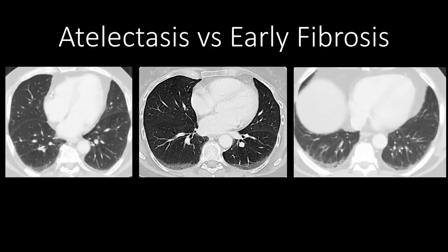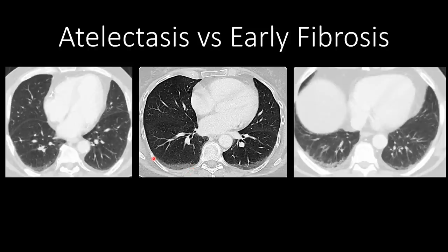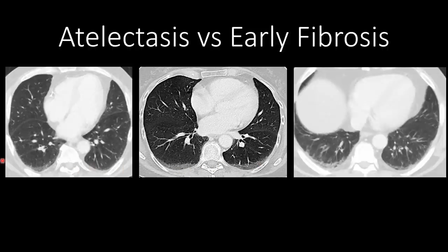When we see peripheral ground glass opacification in the dependent portion of the lung, we often provide a differential of atelectasis or early fibrosis. On high resolution chest CT to assess for fibrosis, we may put the patient prone to shift the dependent portion to the anterior lung and see if it resolves — if it resolves, it's atelectasis; if not, it's fibrosis. This symmetric, dependent ground glass opacity is not the patchy peripheral pattern of organizing pneumonia or viral pneumonia.